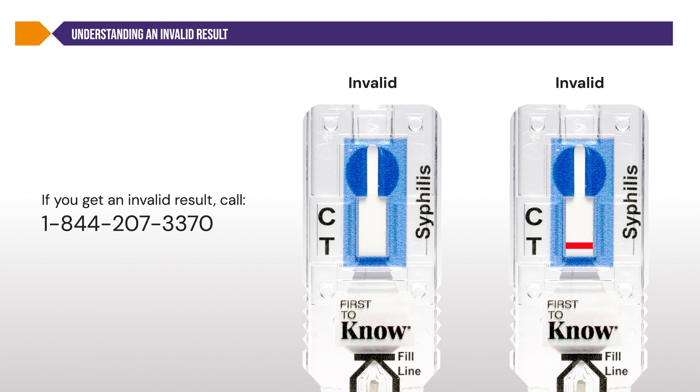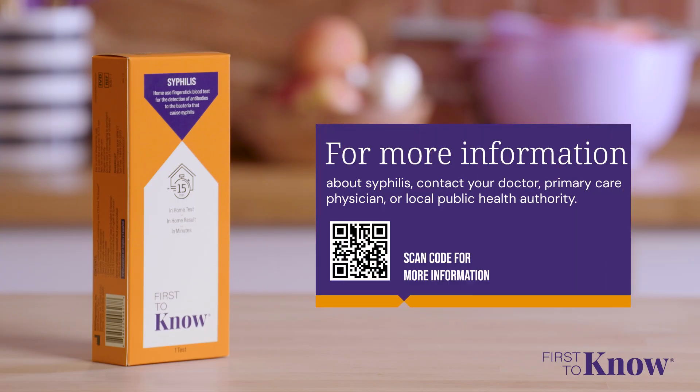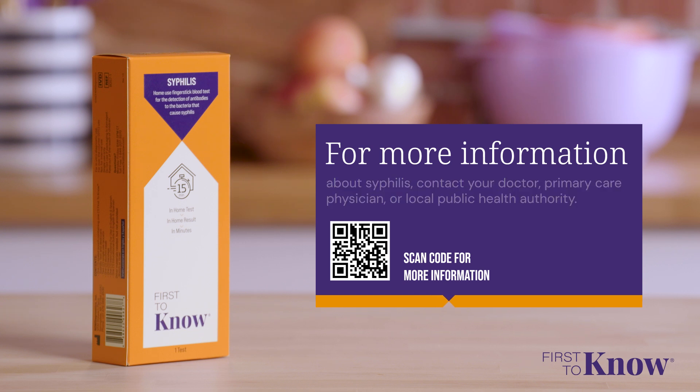For additional information, seek common questions and answers in the complete written instructions for use included in the box. Once you have read your results, dispose of all used test components in your household trash. This includes the lancet, test cassette, and any packaging materials. For more information about syphilis, contact your doctor, primary care physician, or local public health authority. For more information on the First to Know Syphilis Test, visit firsttoknow.com.